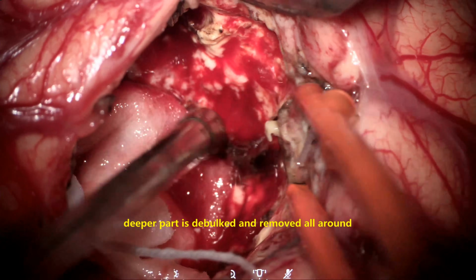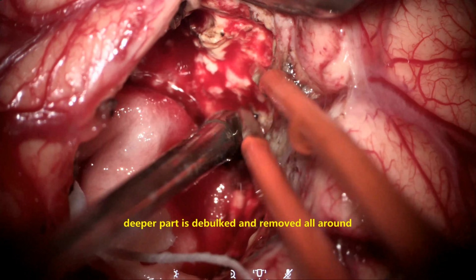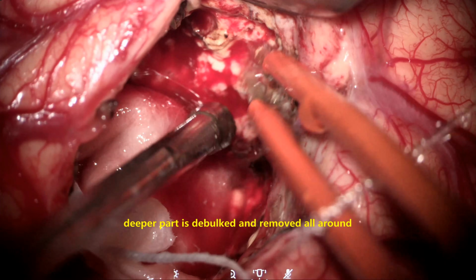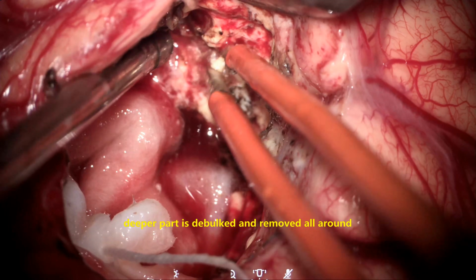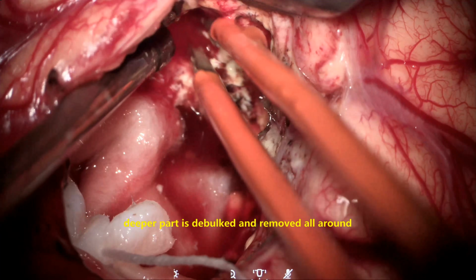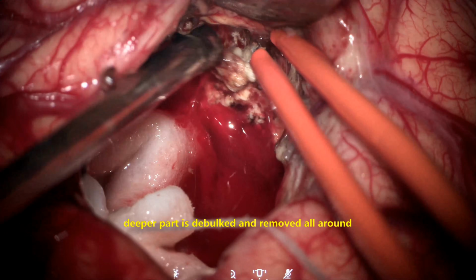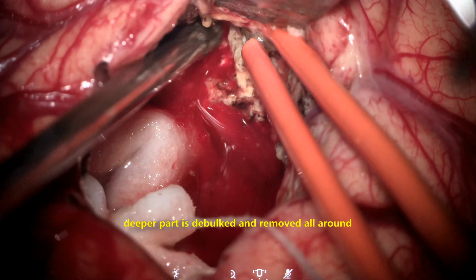Now, slowly under high illumination and high magnification, debulking, achieving the hemostasis, and understanding the boundary between the tumor and the brain is of utmost importance. Understand that normal brain is difficult to suck, whereas a tumor easily comes into suction. That fact needs to be kept in mind in the deeper planes.